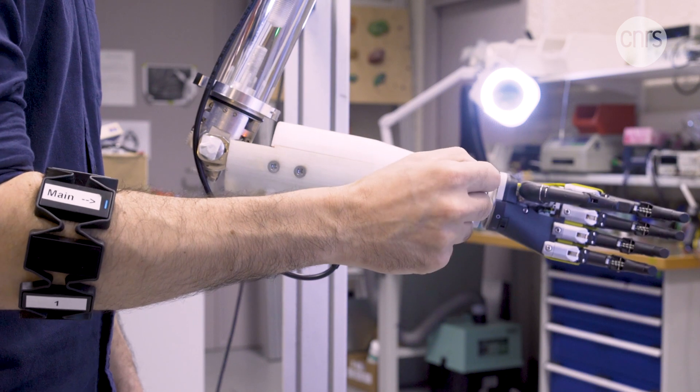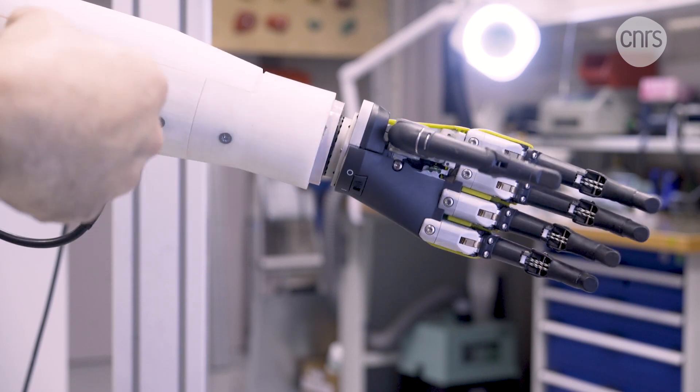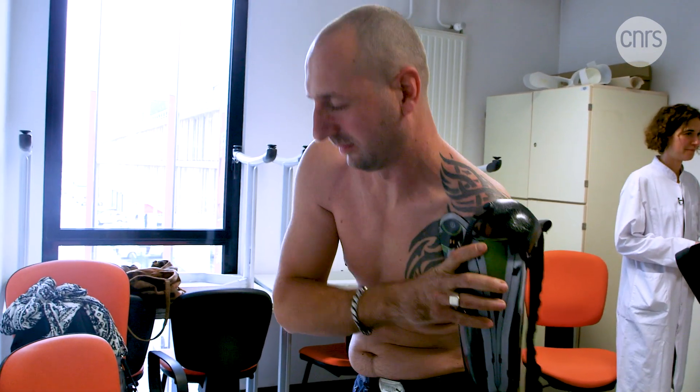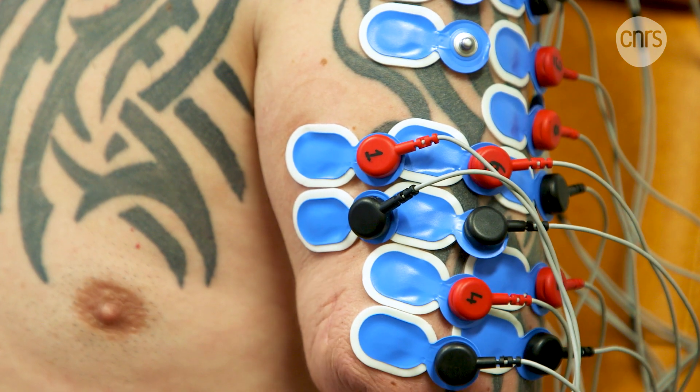We measure electromyography, or muscular electrical activity. By concentrating, the patient can control their robotic elbow. Then, once the elbow is properly positioned, they can send a signal to the prosthesis to say they want to change what they're controlling — for example, move their concentration to the wrist. Much like a musical instrument, using a prosthesis like this requires a lot of practice, especially for people with amputations above the elbow. It's already difficult for patients to learn how to flex their bicep or tricep alone — something that seems impossible, because they usually contract at the same time in order to control multiple parts of their prosthesis. It's really difficult and can be frustrating in the moment.